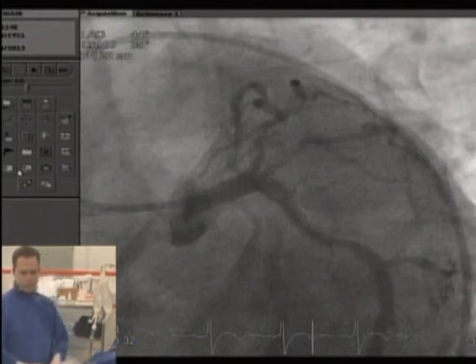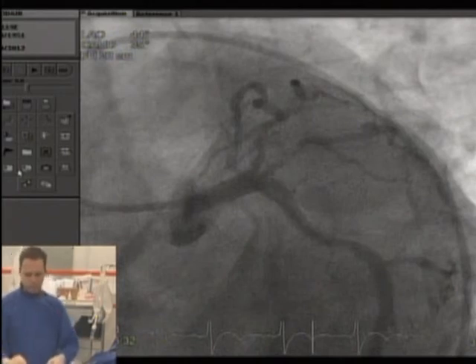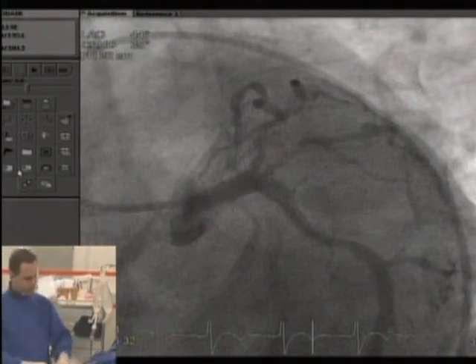So what kind of drug-eluting balloon? Which industry is it? Drug-eluting balloon, we have two here. We have Sequent, please, and we have Dior. Both paclitaxel. Dior, okay, it's available here in Brazil. It's B. Braun and Eurocor.